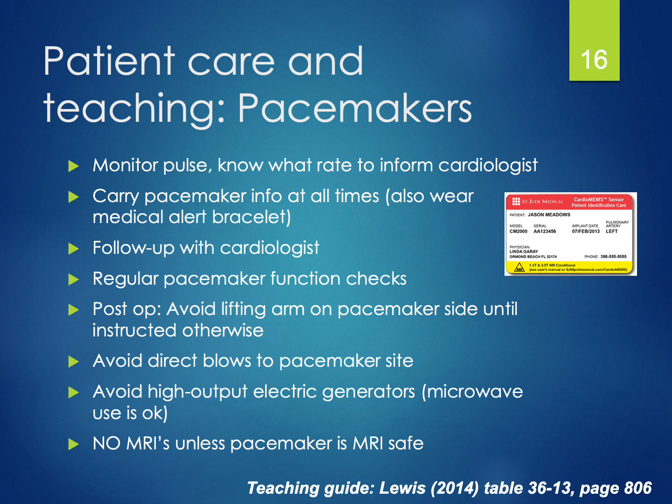They should also avoid high output electric generators, but know that being near or using a microwave is just fine. That is not considered a high output electric generator. And also a patient who has an MRI safe pacemaker can have an MRI, but nobody else. A patient with a pacemaker that is not MRI safe should not have an MRI. And even if they do have an MRI safe pacemaker, there are specific guidelines that should be followed. So these are just a few of the general guidelines that we need to review with our patients with pacemakers.